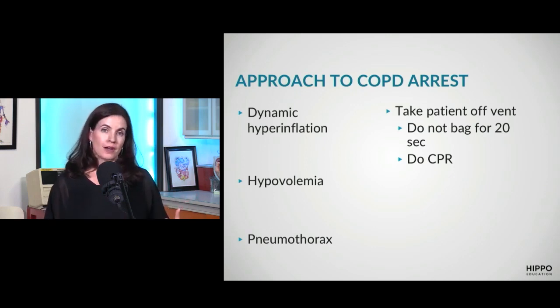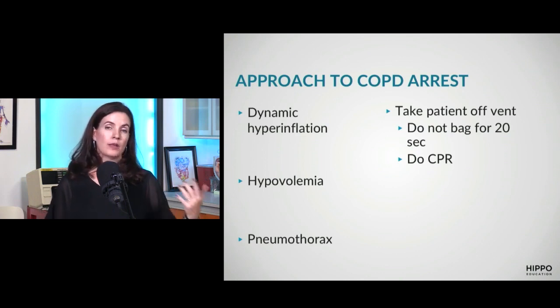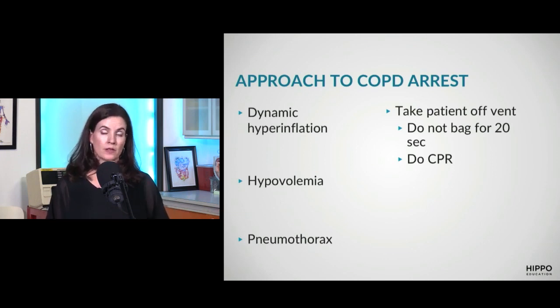Now, during this time, when they are disconnected and you're not bagging, we're doing CPR, which is pressing on the chest and actively helping them exhale. That 20 seconds with CPR is going to fully empty their lungs. And if the original problem was dynamic hyperinflation, they should rapidly get their preload back and they will get return of spontaneous circulation, often within that first cycle of CPR.